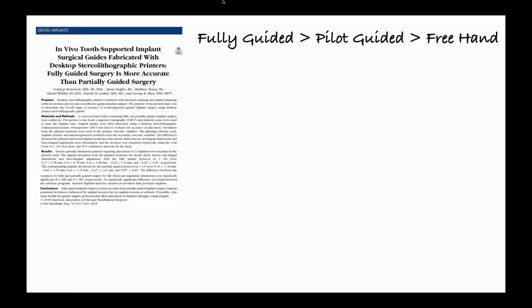From a technical perspective, from a surgical perspective, we have a lot of options right now, which is really an amazing time, obviously, to be in dentistry and implant surgery. We have the whole spectrum of skills that we can use in order to place dental implants. I learned how to place implants freehand. We can do pilot guides. We can do fully guided implant surgery, which could be with a static surgical guide. It could be with a new dynamic navigation system.